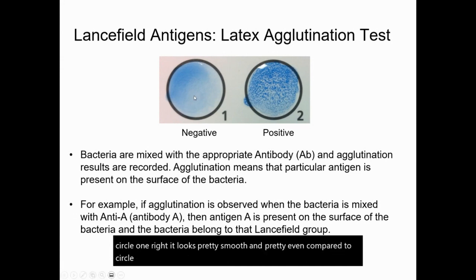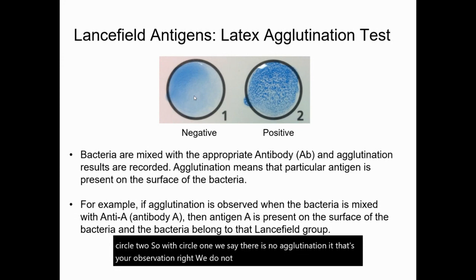With circle one, we say there is no agglutination — that's your observation. We do not observe clumping.